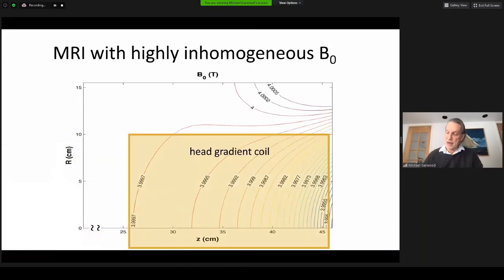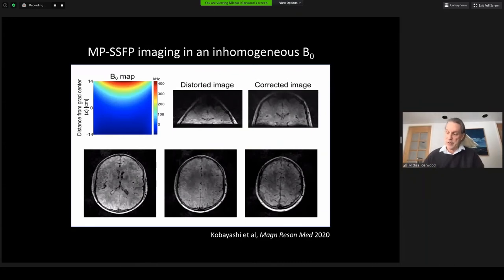In fact, the head gradient was positioned 36 centimeters away from the isocenter of our 4-Tesla magnet as shown here, and we performed imaging with it. Here you can see examples of the images that were acquired. The image labeled distorted image is the raw image with no post-processing, and to the right of that is the corrected image obtained by including in the post-processing steps information about the magnetic field non-uniformity that was mapped, which is shown in the upper left.